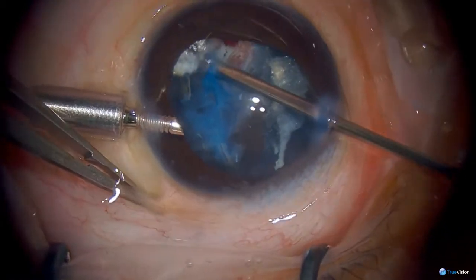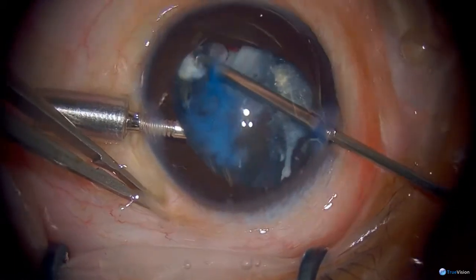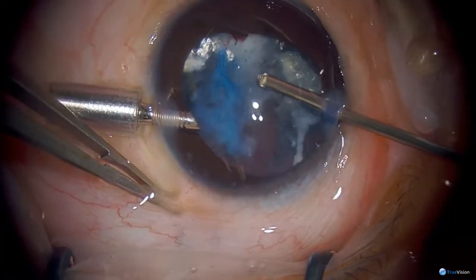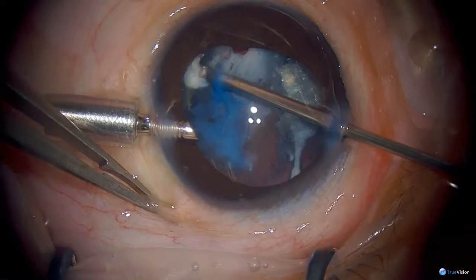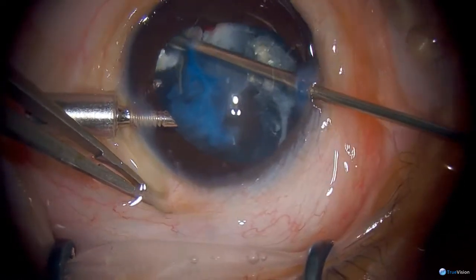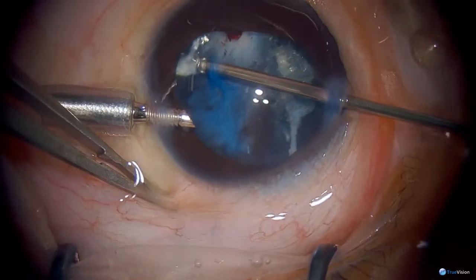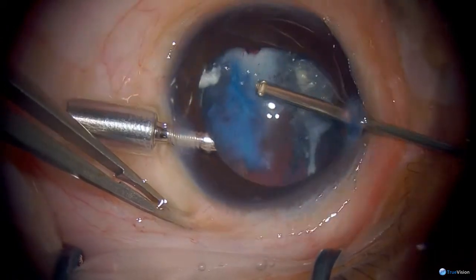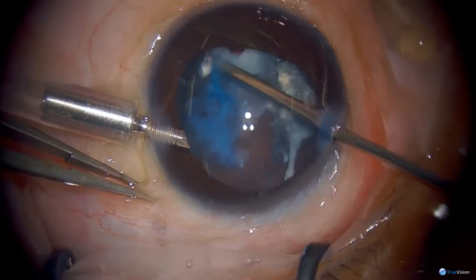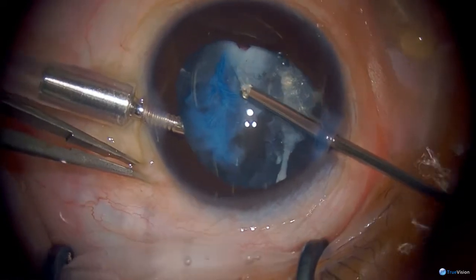And I'm going to just switch my infusion and my irrigation as well. You can see just next to where my cutter is, the anterior and the posterior capsule are fused together, and we're going to use that to keep everything stable. More of this very crystalline material here. I don't know if it comes out on the microscope, but it's very brightly colored, and it has a very iridescent sheen to it.